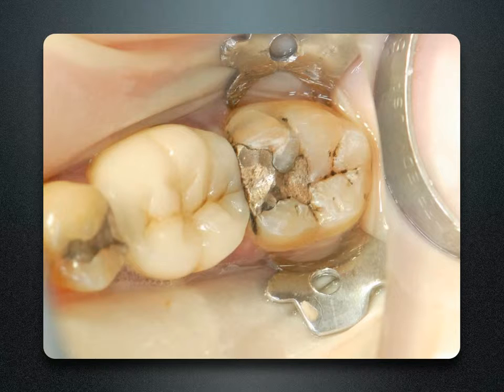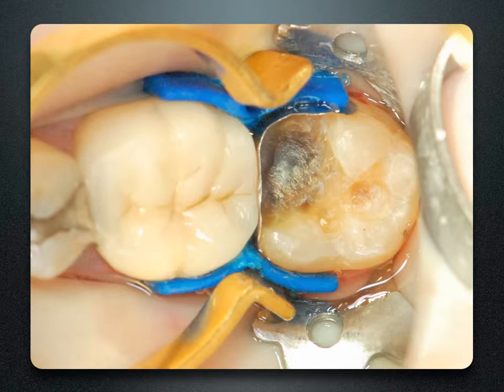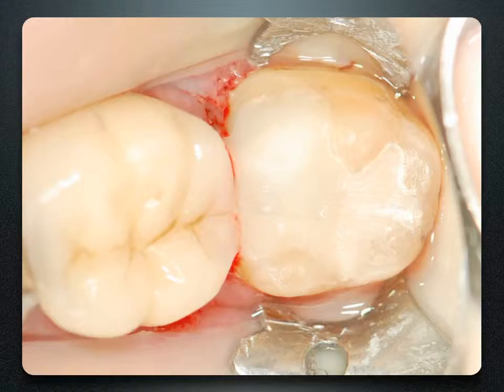Every day, patients walk in with fractured or cracked teeth. This tooth has a fractured mesial buccal cusp. The issue is that when the old amalgam is removed and a separating ring is placed, it crushes the matrix band into the box. By placing the ABC wedge on the buccal and lingual, we can secure the missing cusp, burnish the matrix band against the wedge, place our separating ring, and get a truly anatomic, broad contour.